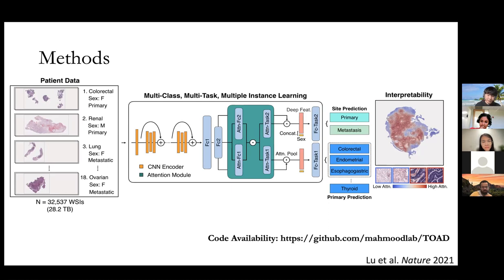So the idea I had, which I'm not necessarily sure fully addresses this issue, but it's just my attempt, was: what if, instead of just using the attention scores, the patches that the model attended to, we actually use that to assign pseudo labels, right? The top K patches the attention model selected are likely to be representative of the class one way or another. And the bottom K, even though I don't know for sure, are probably garbage that you can just toss away and ignore.